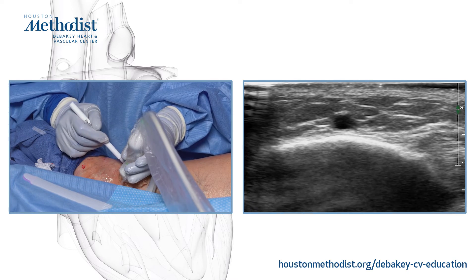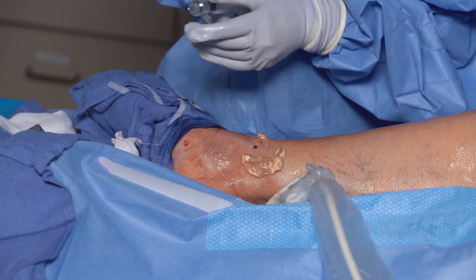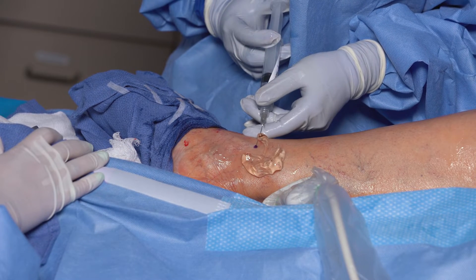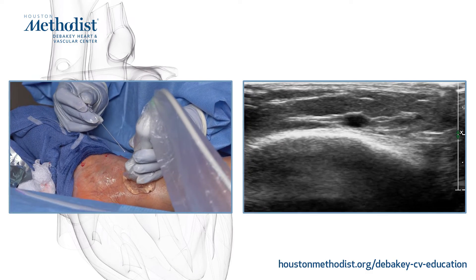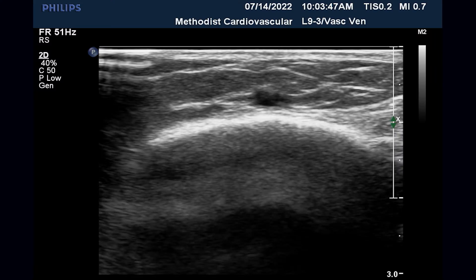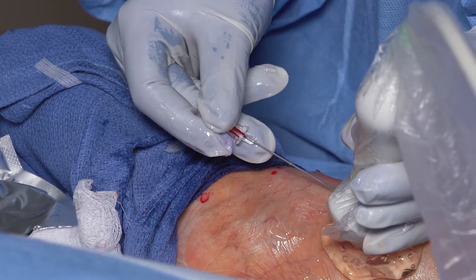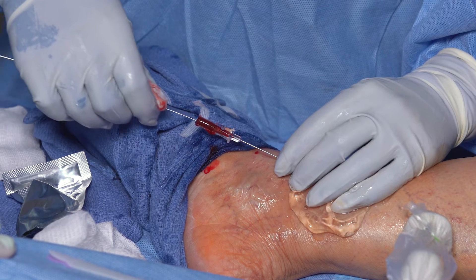Here I am at the ankle. I'm depressing where I want to access and I am going to inject a small wheal of lidocaine — you really don't need much here. Then I'll access this with a micropuncture needle and visualize the needle tip within the vein on ultrasound. When I visualize my tip, I make sure that I have flashback and then I thread the wire, making sure that it's passing easily.